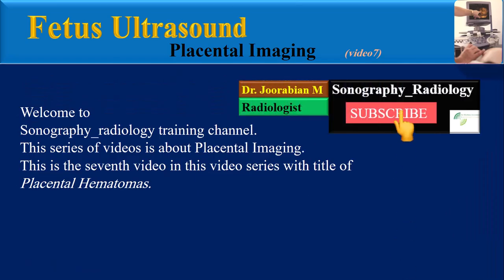This series of videos is about placental imaging. This is the 7th video in this video series with the title of Placental Hematomas.